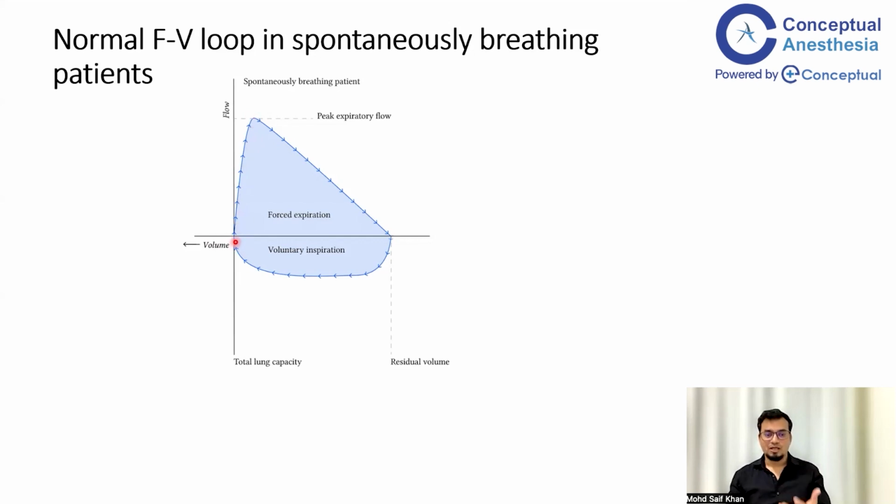as you leave the air out of your lung. What will happen? There will be a flow, the expiratory flow, and it will be very rapid. As you can see, this curve approaches the maximum very fast, and then this part is a little slower. So the flow increases, goes to a maximum, and then starts decreasing later, in the later two-thirds, or you can say 75%, of the time of expiration. Initially it goes very fast to the maximum flow.